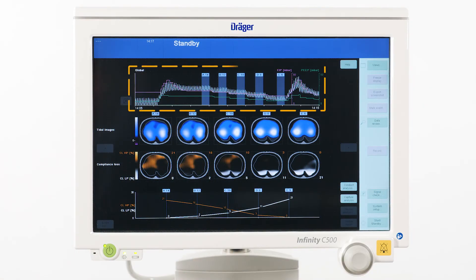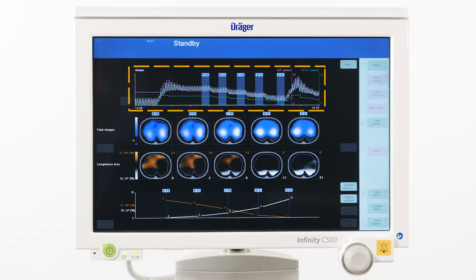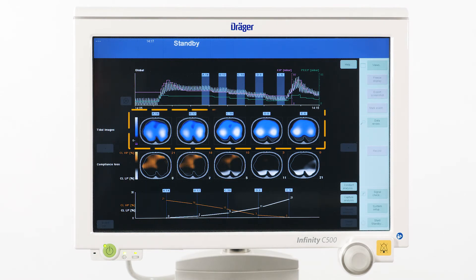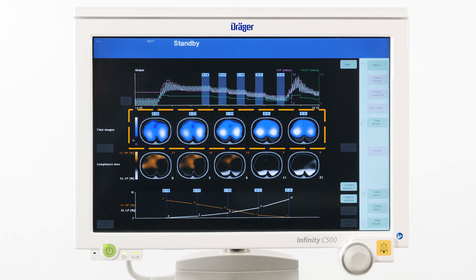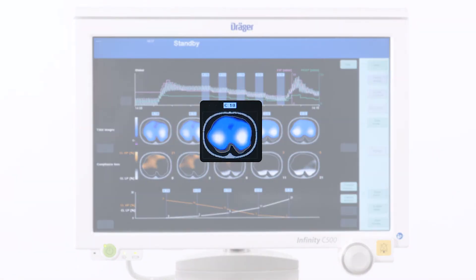The waveform at the top serves mainly as a navigation aid, allowing us to easily recognize which parts of the trend data are reflected in the analysis. In this example, five PEEP steps have been identified and for each step the corresponding tidal image is displayed. The series already shows nicely at which PEEP level major lung collapse starts.